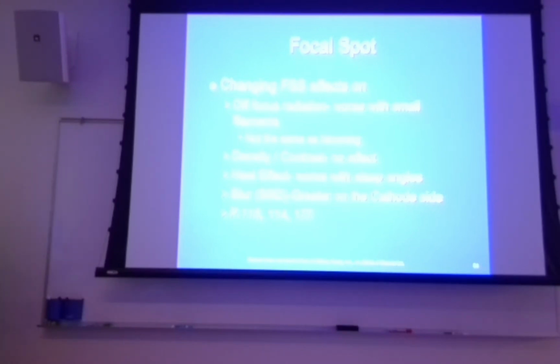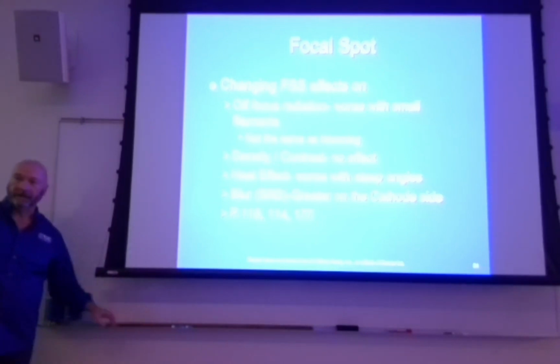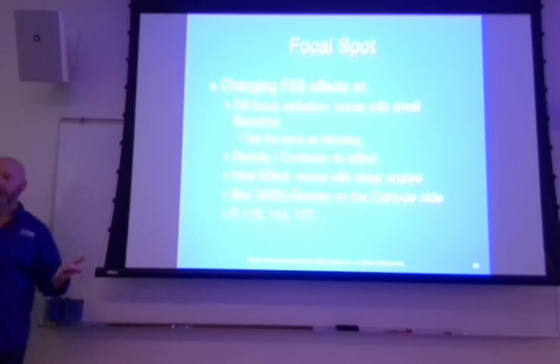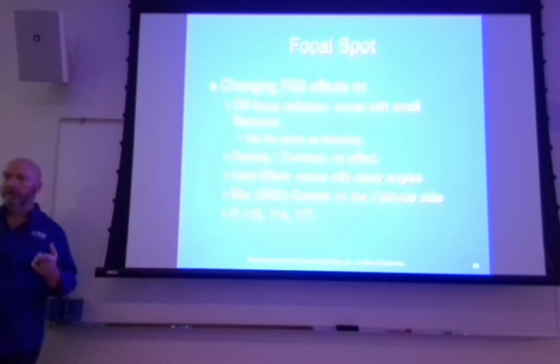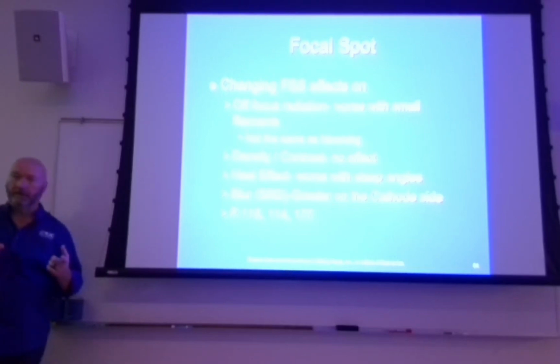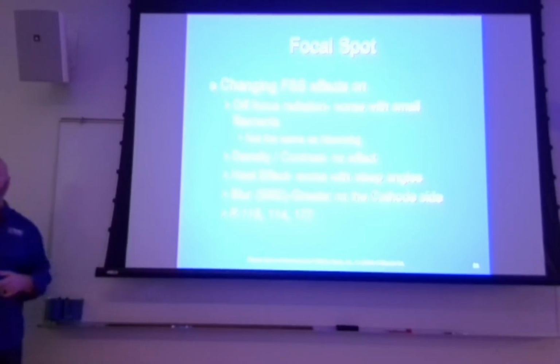So during exposure, you still got a positively charged anode and a negatively charged cathode and electrons, right? So if the anode end is still positively charged and the electrons are negative, where are they going to try to go? Back towards the anode, right? And if they make it to the anode, with high enough energy, they're still going to potentially create an X-ray photon.